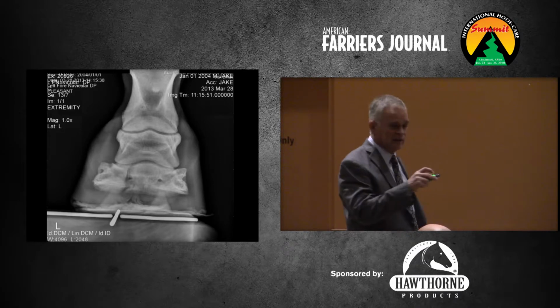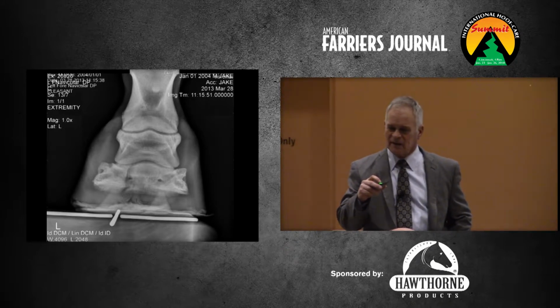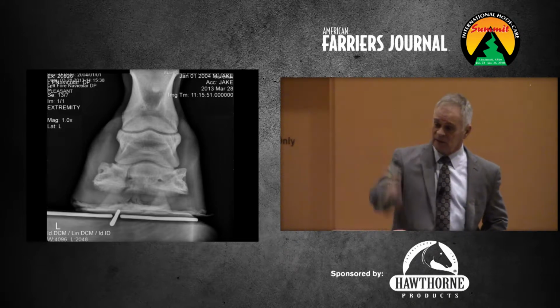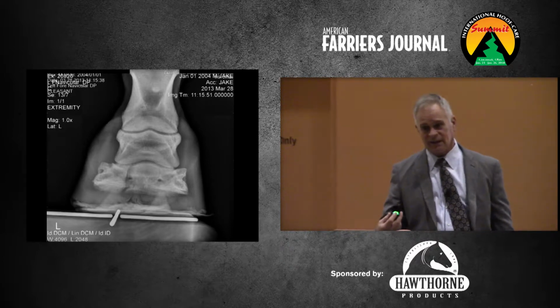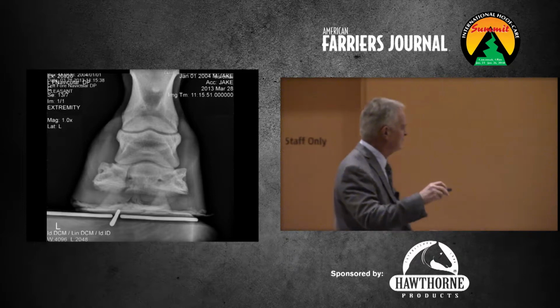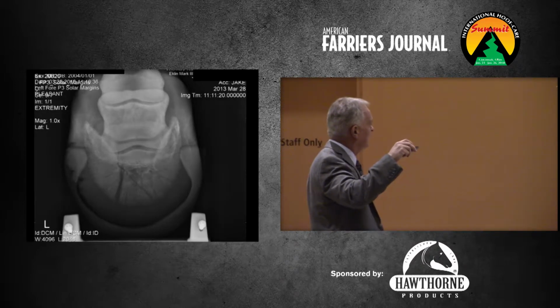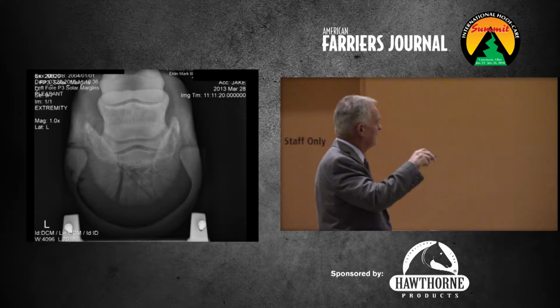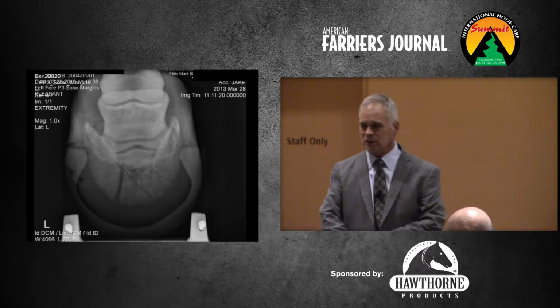And I'll admit, once I took that one and I saw that line there, I'm like, does this horse have a toe crack? And I went around, because a toe crack might look like that because you're looking through, and I looked back at the front and there was nothing. I looked at the heels and there was nothing, so then I took a 65-degree DP. So this horse got his foot caught in something, somehow just blew apart.